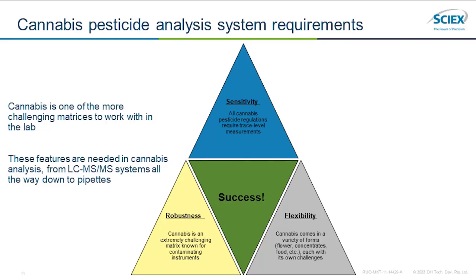So from your LC-MS system all the way down to your pipettes, you kind of need to evaluate them using these 3 parameters if you want to be successful.